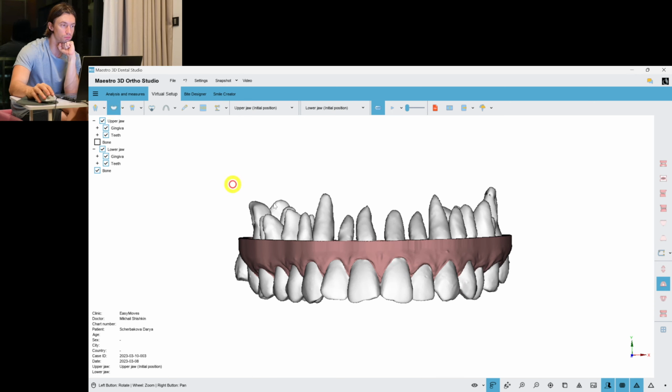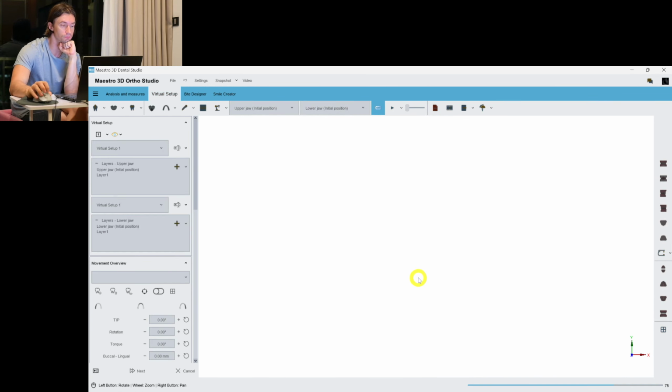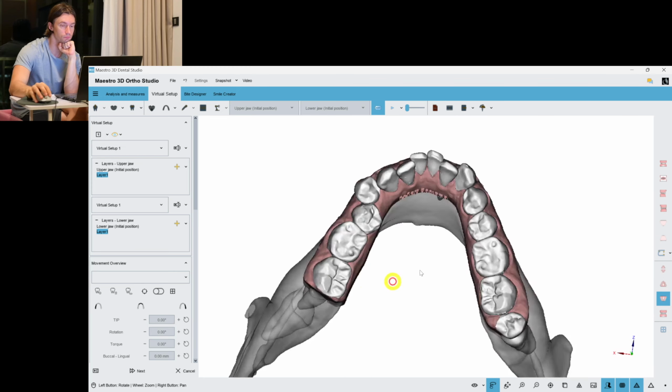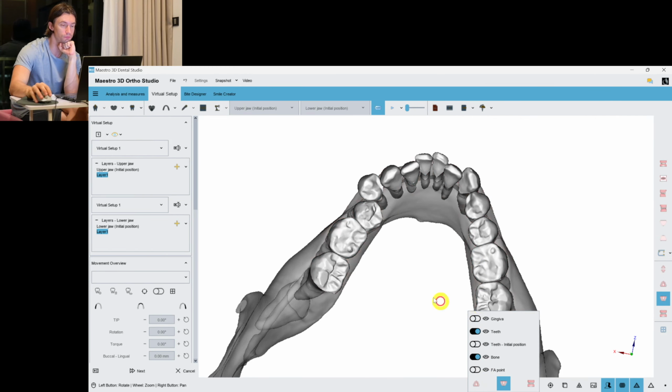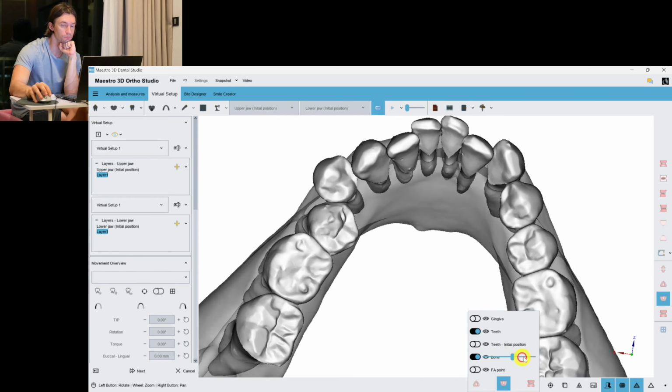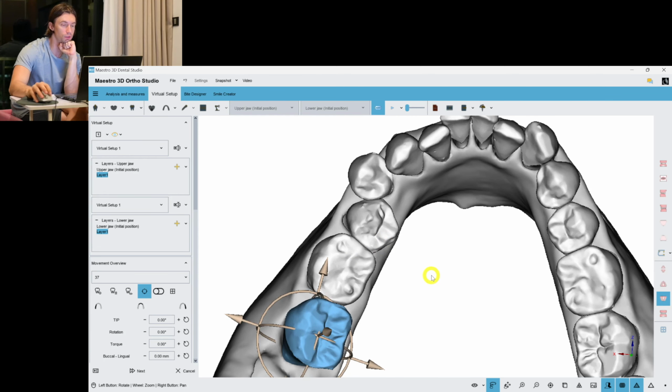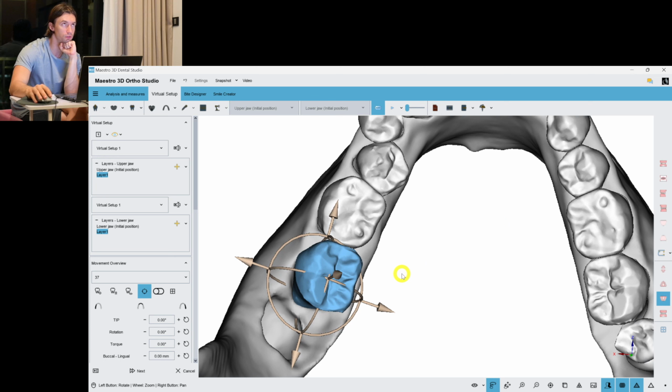Let's go to virtual setup. And we'll start with the lower jaw. Let's turn the gingiva off. And start. How much space do we need? I think about 2 millimeters. So in degrees of tipping, it's gonna be about 10 degrees, I think. Yep, about 10 degrees.